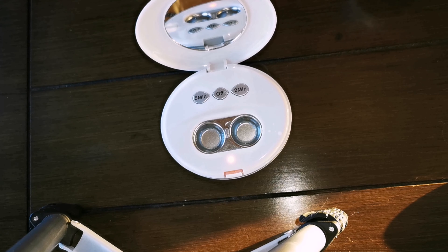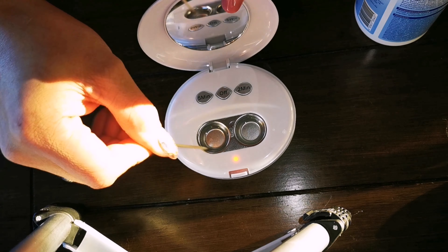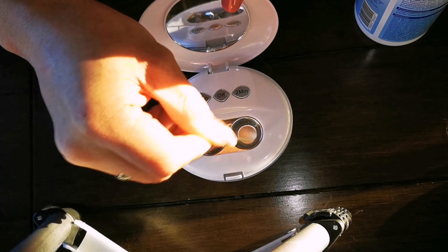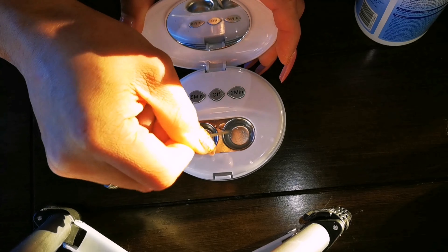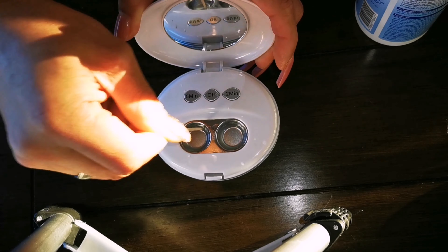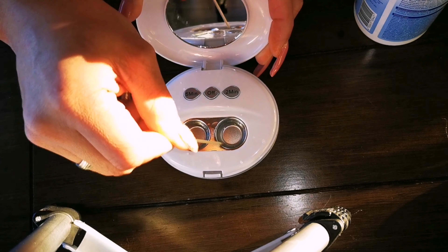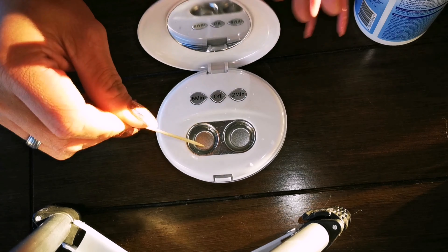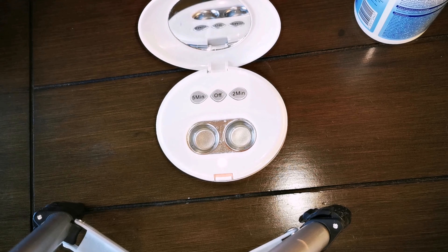When buildup happens, you run it for 15 minutes — three rounds of five minutes — and scratch it with a toothpick. This is the reason why you cannot use this device as your contact lens case like you normally would. This is just for cleaning. Your contact lens case should be separate, and you use this only for cleaning your contact lens before you wear it.